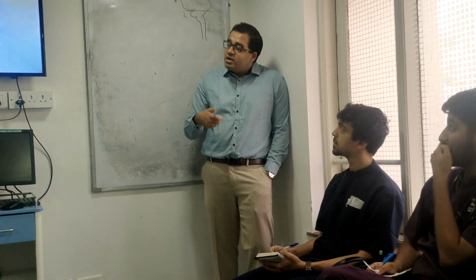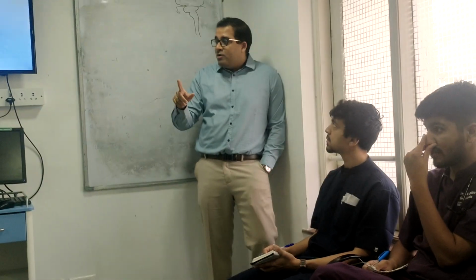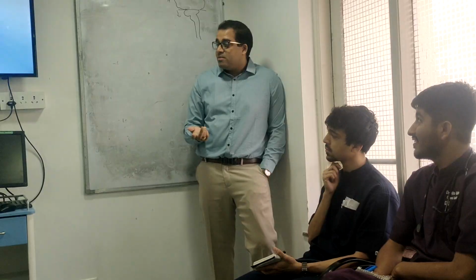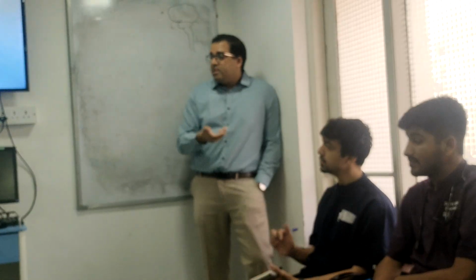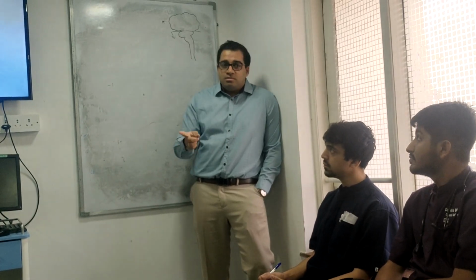Okay, if you're immediately putting a central line, put in a line, take in a sample, label it as peripheral sample. You don't want it to be mislabeled as line-related infection and फालतू में line निकाल. Okay, because that will be as good as a peripheral sample. Otherwise, suppose मुझे 6 ml blood मिला, 10 ml मिला और फिर vein collapse हो गया. Put that into a single bottle.